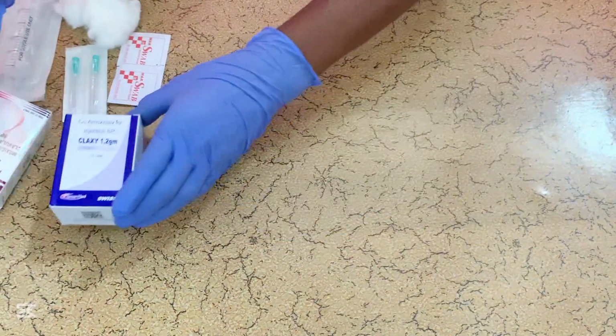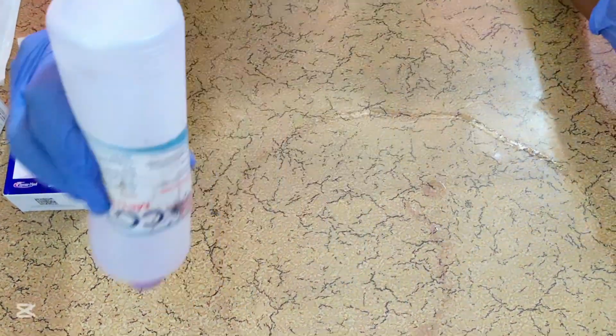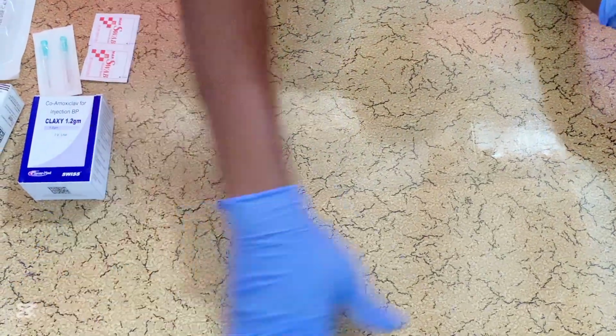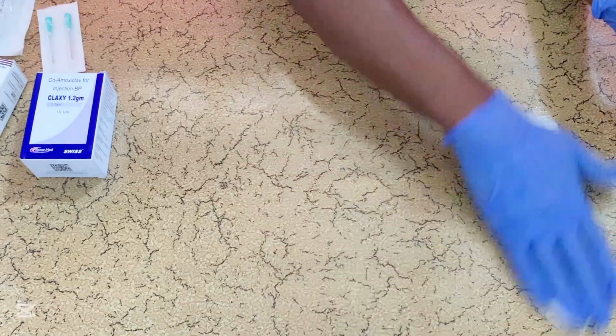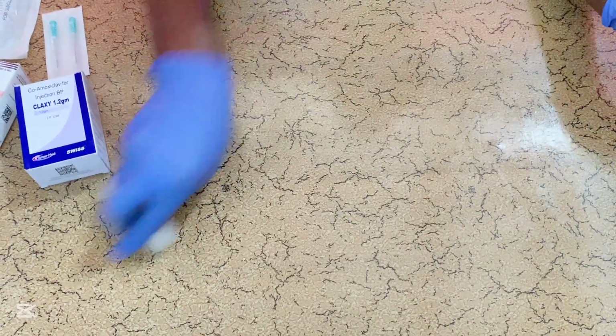Before you start, make sure that you clean your working bench. To maintain sterility of the drug, make sure you clean your working bench first, before you start loading the injection or reconstituting the drug. This is how you are going to perform.